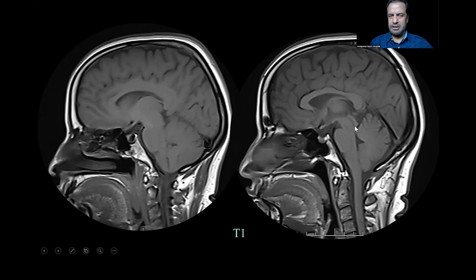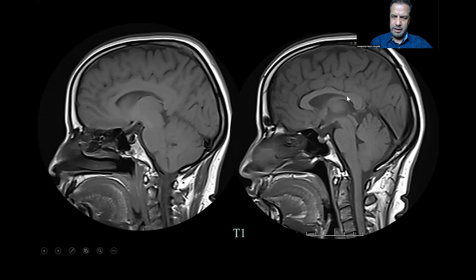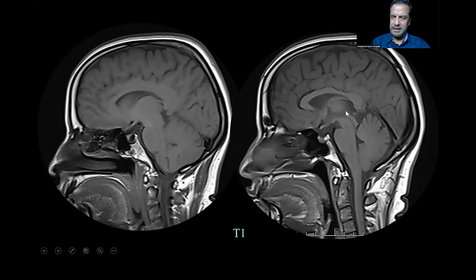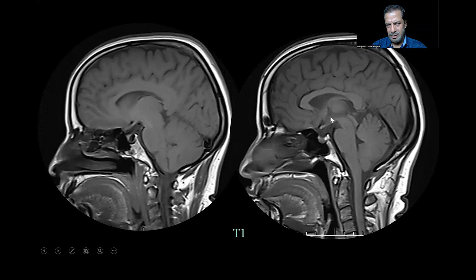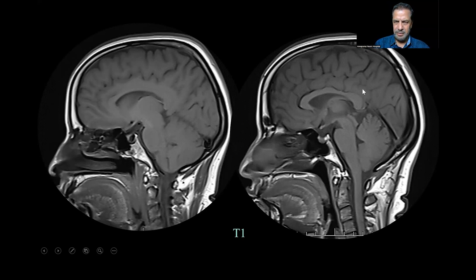This is the aqueduct of Sylvius, the foramen of Magendie, and the quadrigeminal cistern. This is the pineal gland, and this is the corpus callosum. This is the fornix, which is part of the limbic system. This is the massa intermedia, the connection between the two thalami. This is the third ventricle, where you perform a third ventriculostomy by coming through like this.